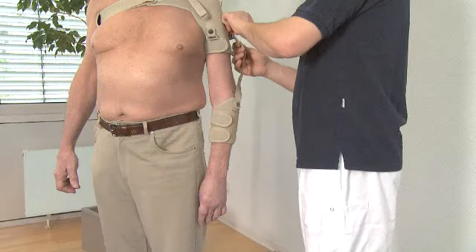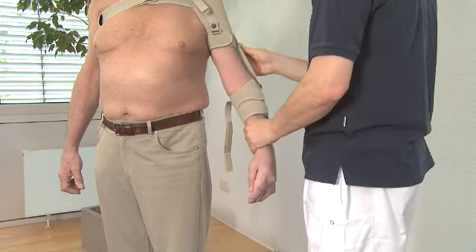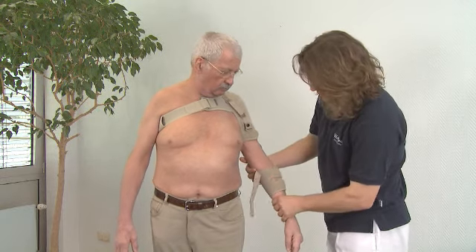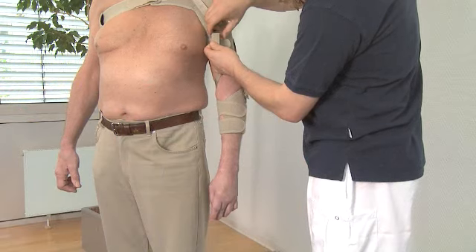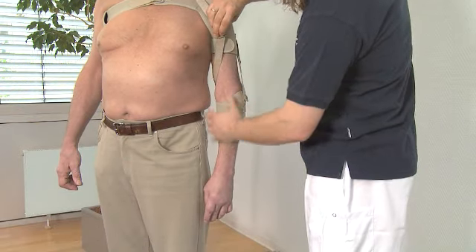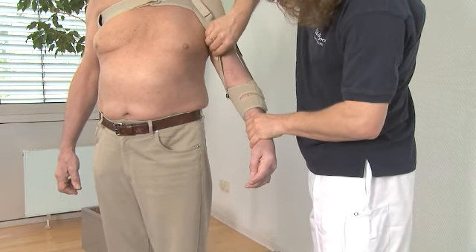Attach the straps between the upper and lower part. Outward rotate the arm when you close the press buttons. The golden press button should be fastened to the golden press button and black to black. Adjust the straps to make sure the arm becomes slightly outward rotated.